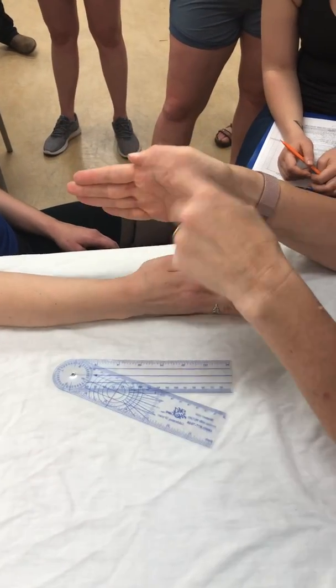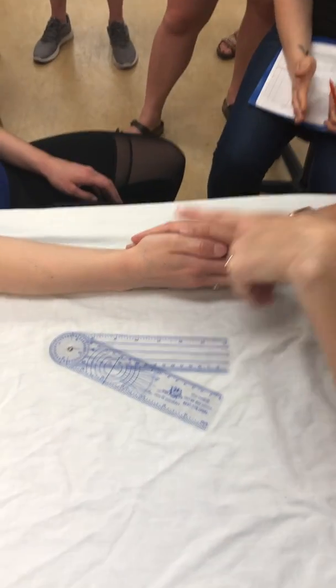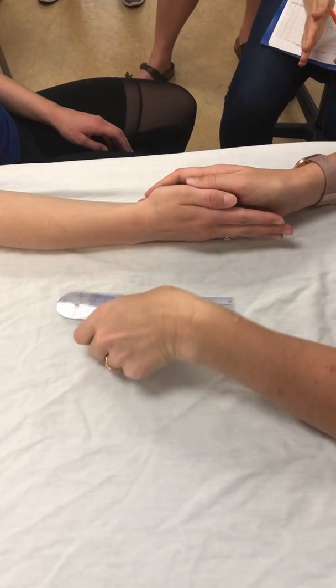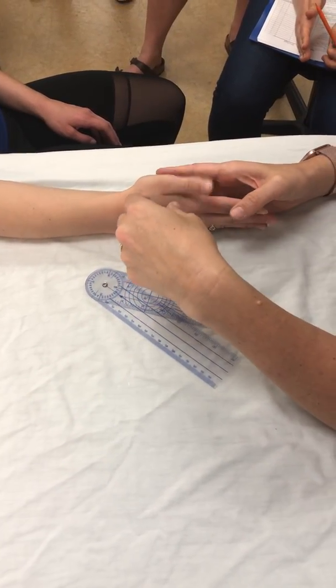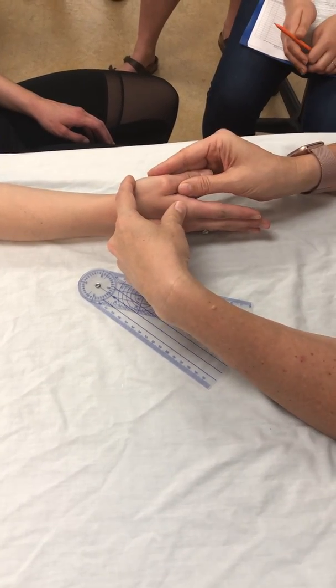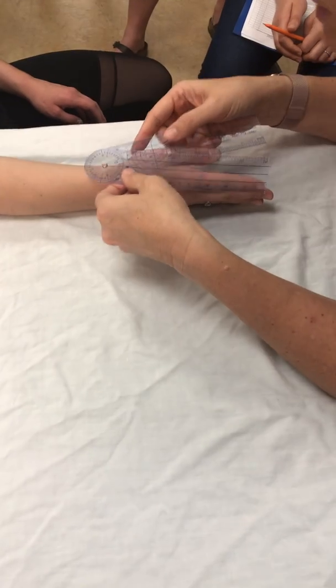If your patient is able to get her, in this case, Christine's thumb right on top of her hand, that's our 0. Okay? So what if I can't? If for some reason you were stuck out here, we would take that measurement, and that would be your measurement.